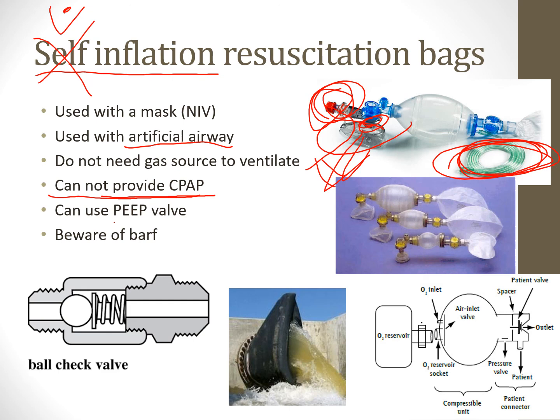And that's why with little babies, you might see us use a flow inflation bag a lot, because it can provide CPAP, but self-inflations cannot provide CPAP. So we can use a PEEP valve, but it's not the same. It's just providing positive end-expiratory pressure, not continuous pressure.